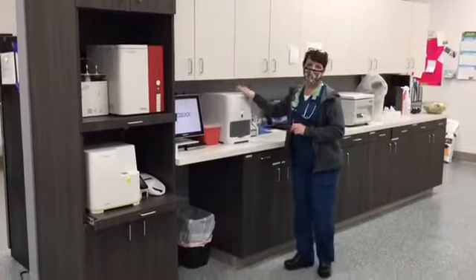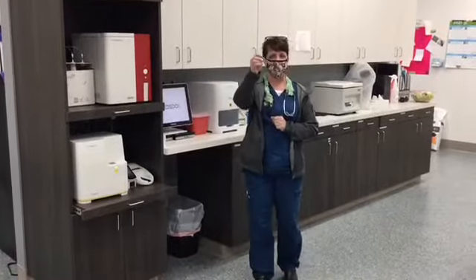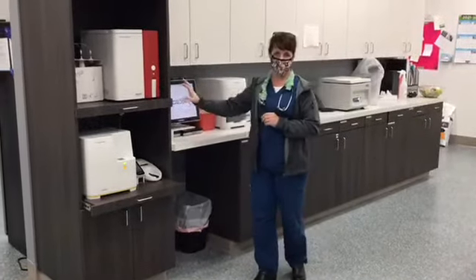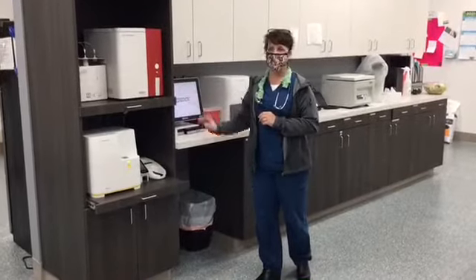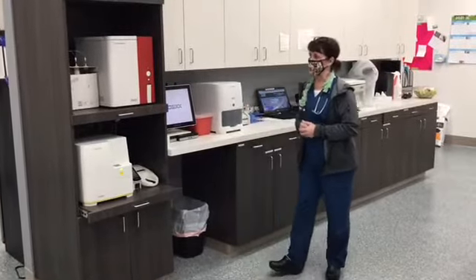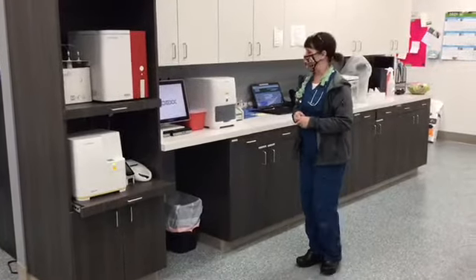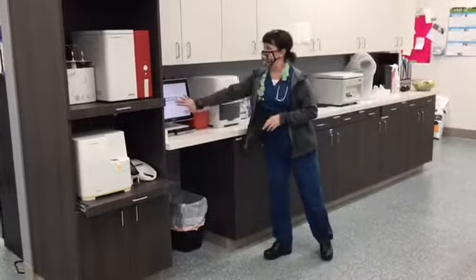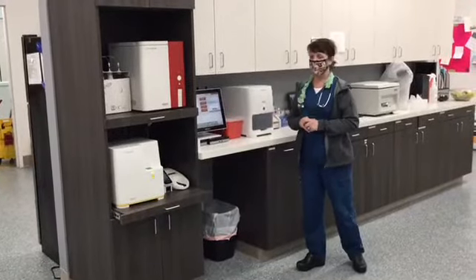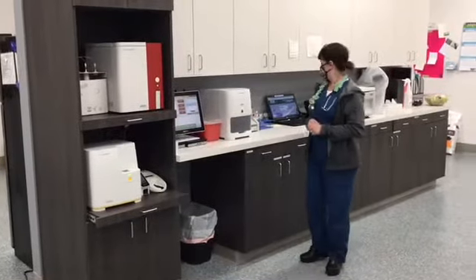Okay. So this is where we do lab work. This right here is a tube that we took a little blood from a patient today. And these are the instruments that we use to check for disease and illness in blood and urine. So we run these machines, and we can do that while the patient's here. We will take those blood samples and run the tests on the machines, and then it gives me some information here that the doctor will take a look at, and we'll make sure that the animal's healthy. If not, then the doctor knows that as well, and we kind of go from there.